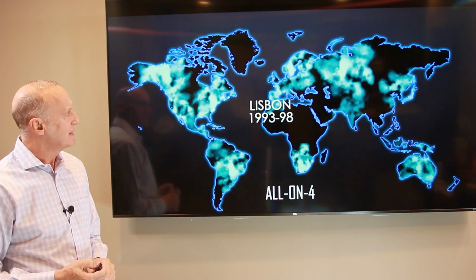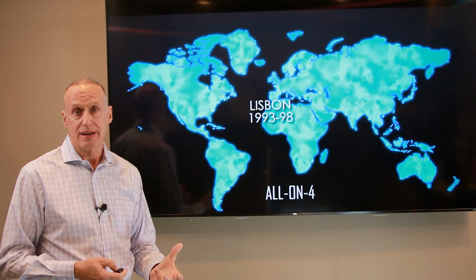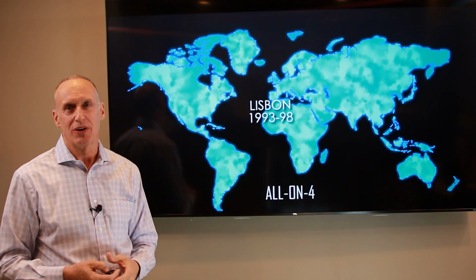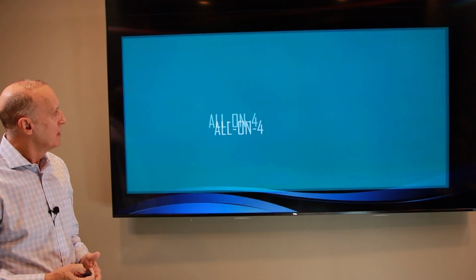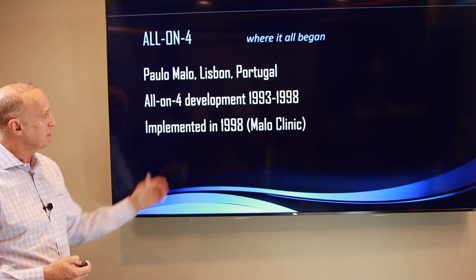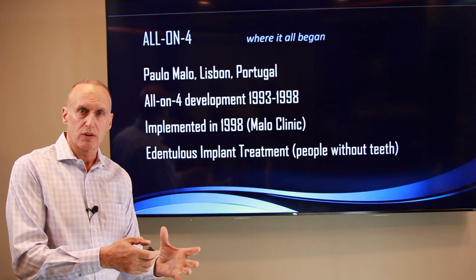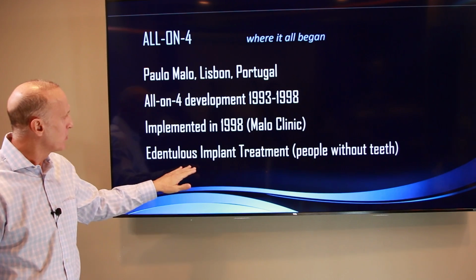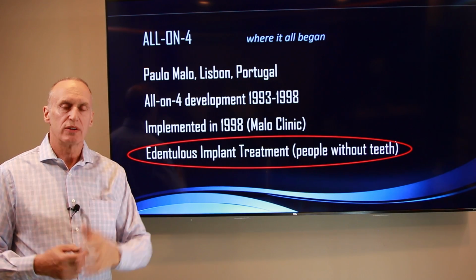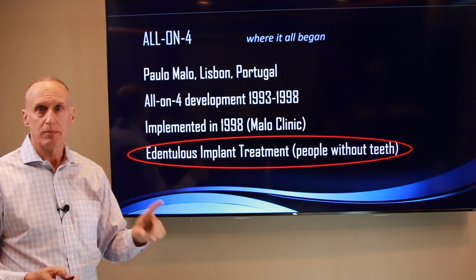It really started in about 1993 to 1998, but the clinic in Lisbon, Portugal, opened for business doing All-On-4 in about 1998. And over the next 20 years, it spread to be this worldwide pandemic treatment protocol that I don't really approve of. So, like I said, Dr. Malo in Lisbon, Portugal, developed this technique, implemented in his clinic in 1998, and it was developed just like Dr. Brånemark's protocol. It was developed and intended for people that were already missing their teeth. Now, this is of paramount importance in you understanding the difference between implant bridges and implant dentures or All-On-4. Intended for people already missing their teeth.